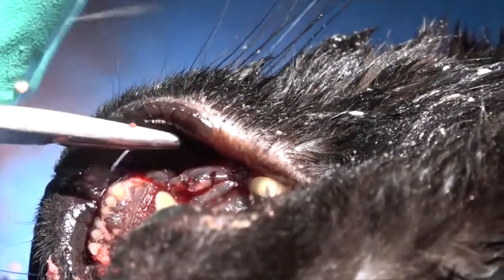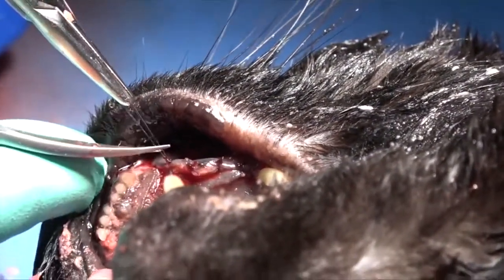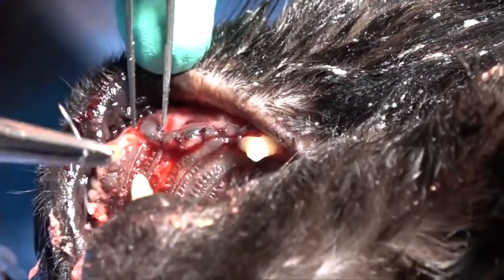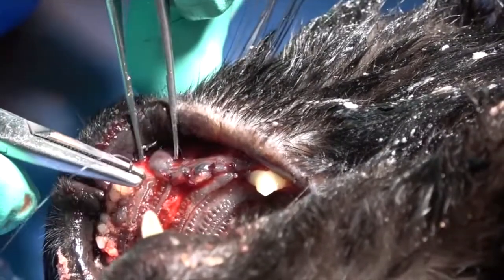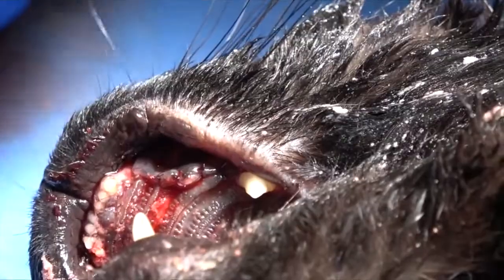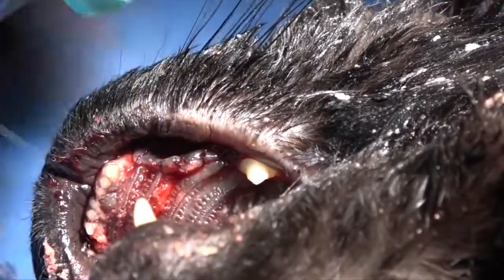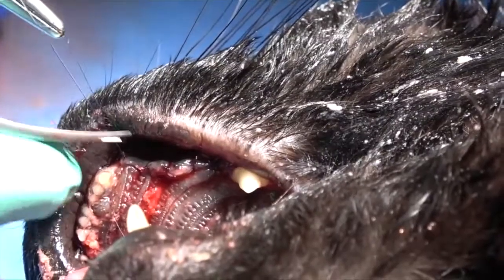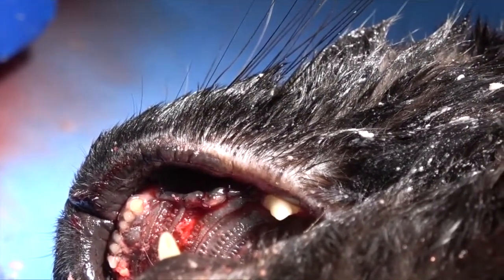We use 5-0 monocryl. In our practice, we find that it moves very easily through the tissue with no tissue drag. It does hang on for about three weeks, which can be a concern in cats with stomatitis where we don't want the suture remaining to cause inflammation, but the benefits and the speed of closure with monocryl far exceed any problems from retention of those knots. In dogs, we would use 4-0 monocryl. We use a PS2 or PS3 needle; for the 5-0, we use a P3 needle.